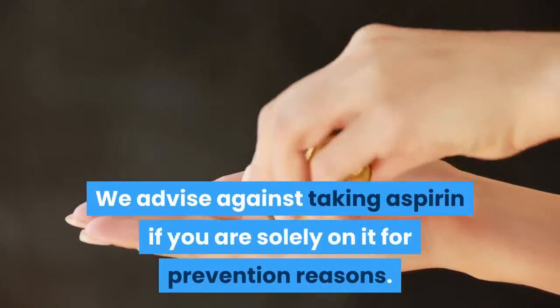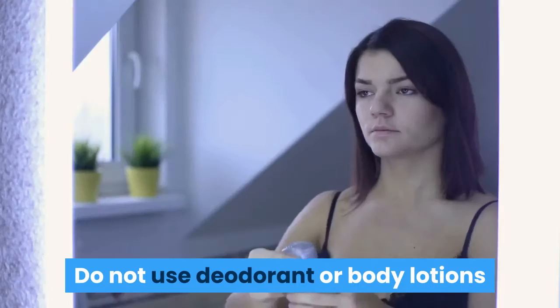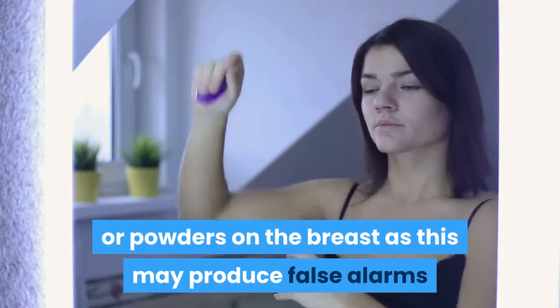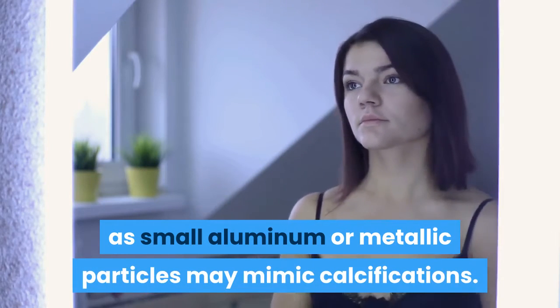We advise against taking aspirin if you are solely on it for prevention reasons. Do not use deodorant or body lotions or powders on the breast, as this may produce false alarms, as small aluminum or metallic particles may mimic calcifications.